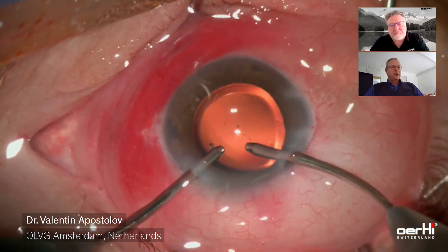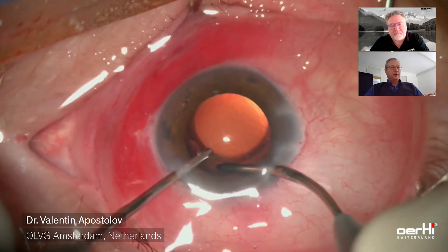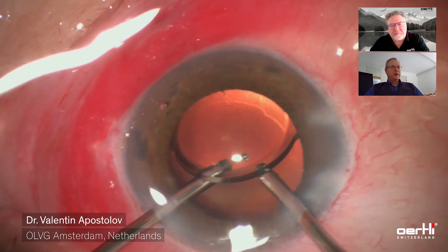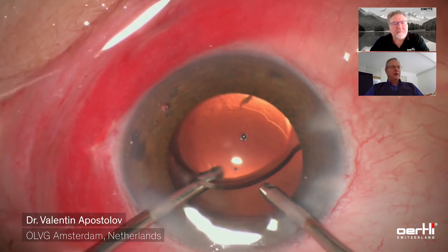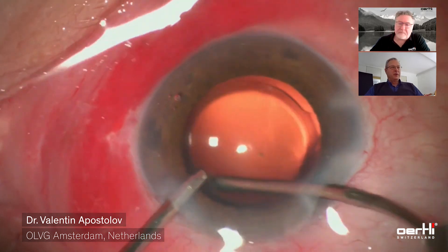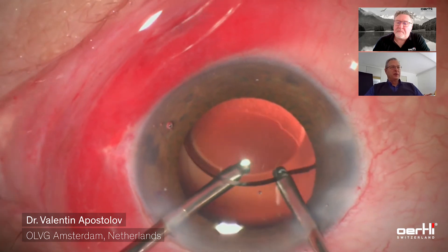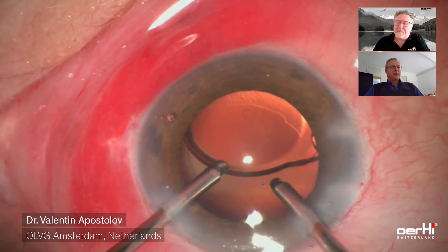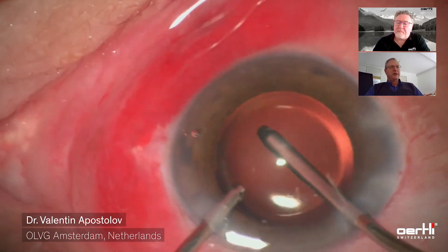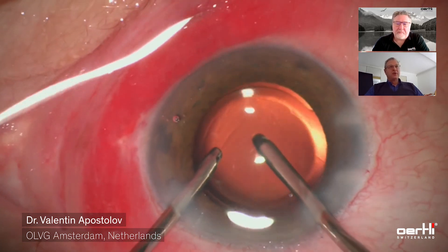The OVD needs to be removed from behind the lens. That's done traditionally by aspiration, but don't forget you can also flush the OVD away with irrigation. If you look carefully, you can see a little amount of OVD left at the six o'clock position, so I rotate the lens and remove the last bits. Next, I try to position the lens with the optic-haptic junction at the temporal side, which should diminish the occurrence of negative dysphotopsia.